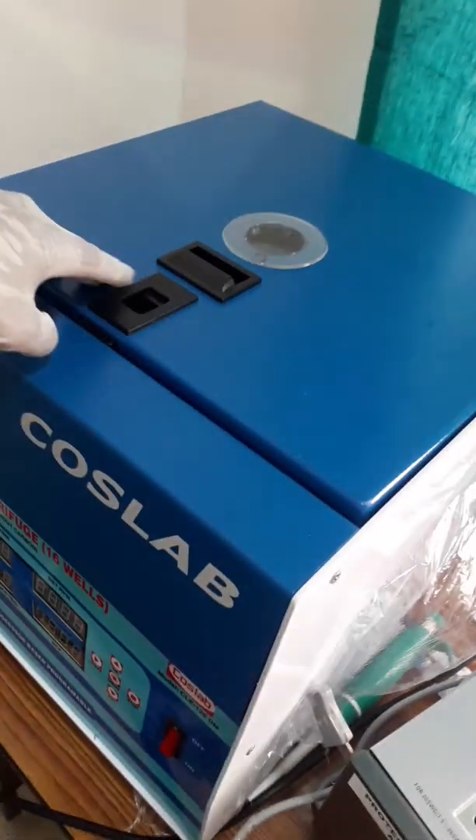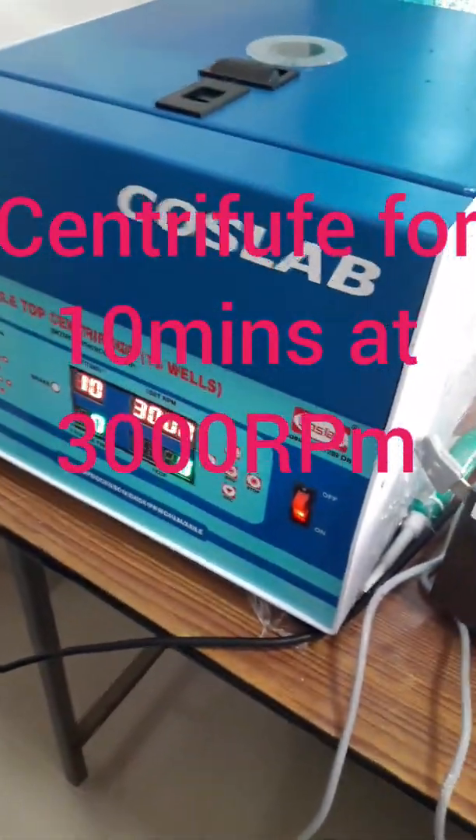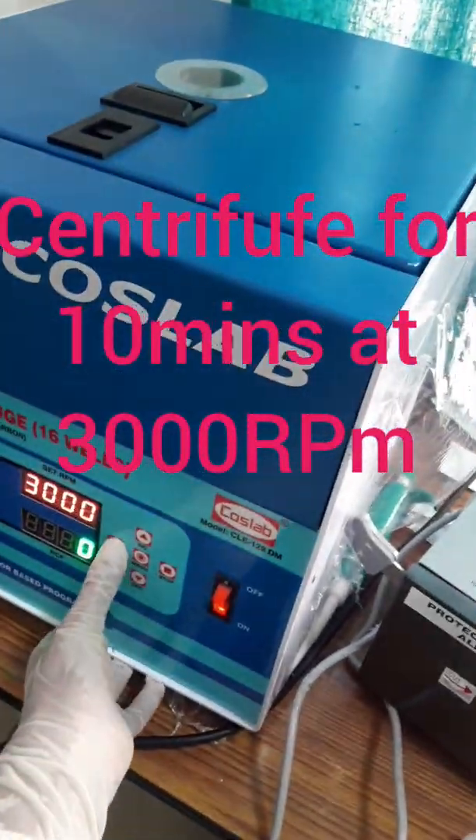After collecting the blood from the patient, we have to store the blood in a vial and centrifuge it for 10 minutes at 3000 RPM speed.